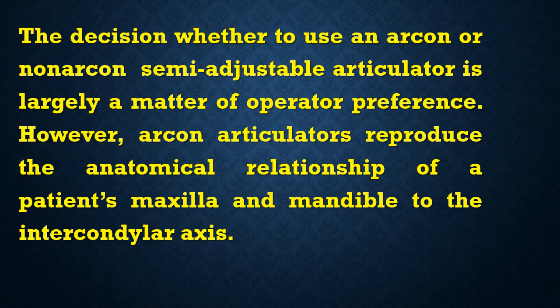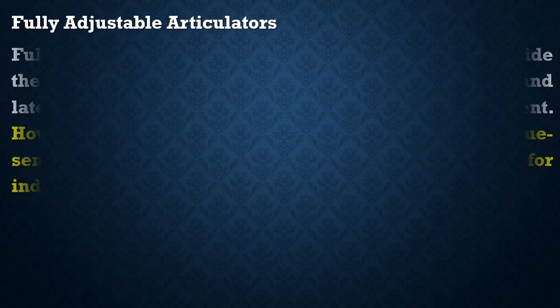Well, the decision whether to use an arcon or non-arcon semi-adjustable articulator is largely a matter of operator preference. However, arcon articulators reproduce the anatomical relationship of the patient's maxilla and mandible to the intercondylar axis. As I said previously, it is more accurate than the non-arcon one.